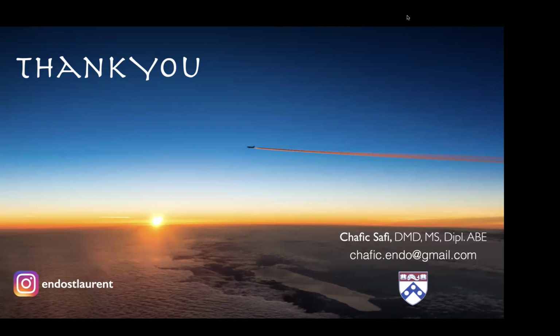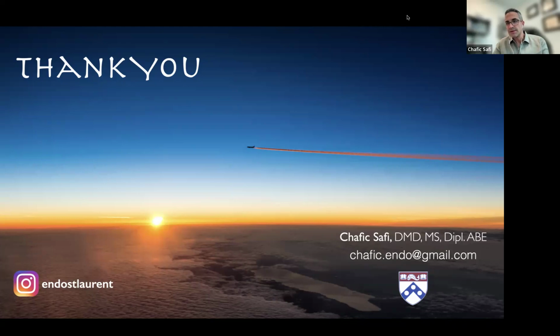Can anatomically centered endodontics be applied to retreatment cases? And if so, how does it affect the approach? So if I understand well, the question is, can we use ACE in retreatment? And yes, of course you can. ACE in retreatments is a protocol that I shared before in the slide, where you have the first step, which is the de-obturation, and the second step, which is regaining microbial control anatomically. If you do a retreatment using the ACE technique, you're able to get a faster, cleaner canal with less gutta percha and less material inside, and it just makes your treatment much, much faster.